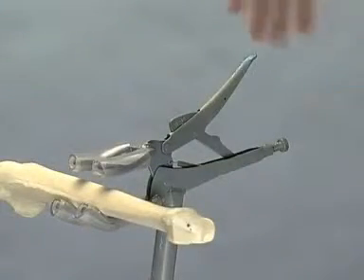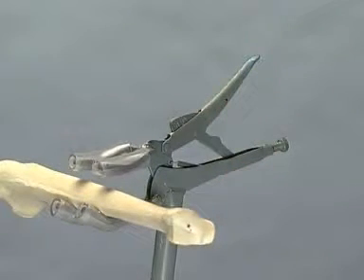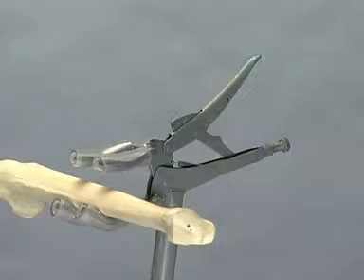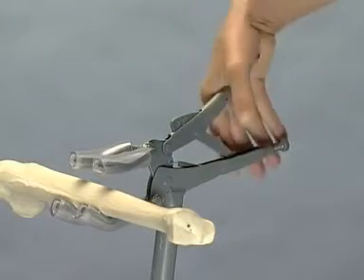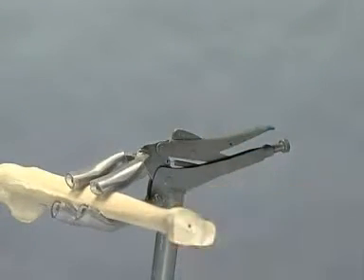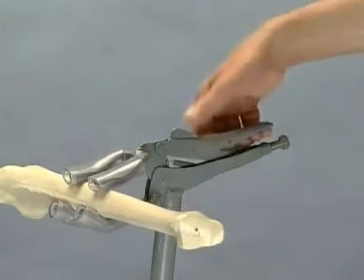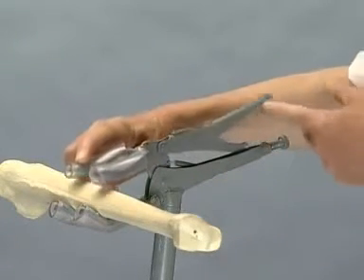The placement of the bone in the vise. The tension can be optimized by turning the screw at the end of the lower handle. If the bone is fixed in either too tightly or too loosely, the vise may spring open. This is how the vise may be reclosed.